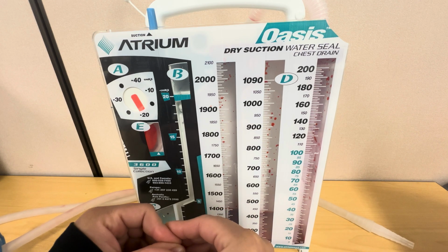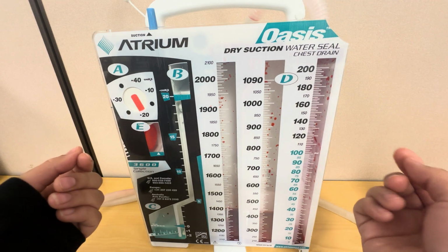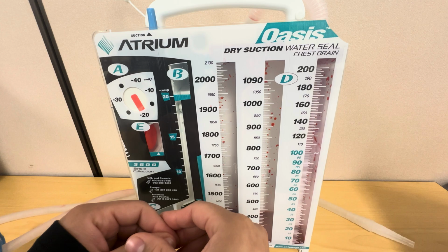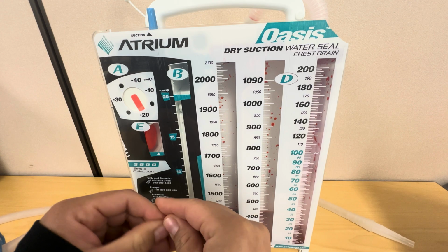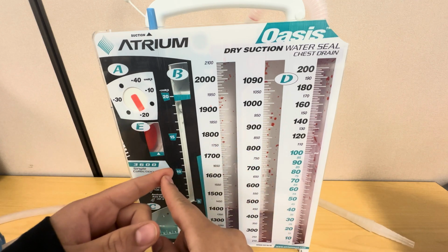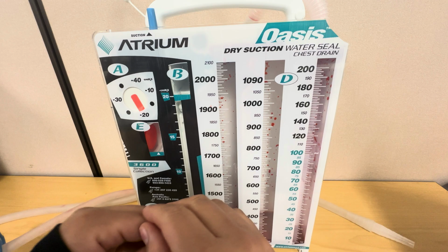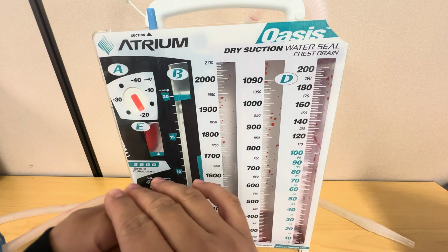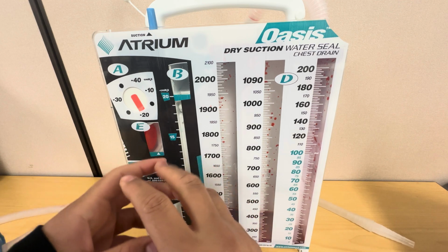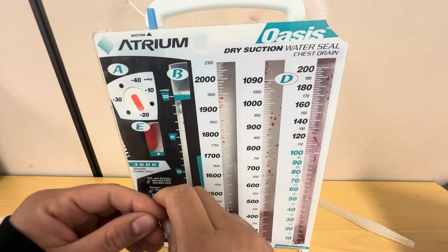We want to also monitor the insertion site, so where the tube is inserted on the chest cavity. Usually what will happen is something called subcutaneous crepitus. So this occurs when air is escaping into the tissues. So upon palpation, it'll feel like Rice Krispies, where there's crackling. So it's very important to monitor the patient's insertion site as well.